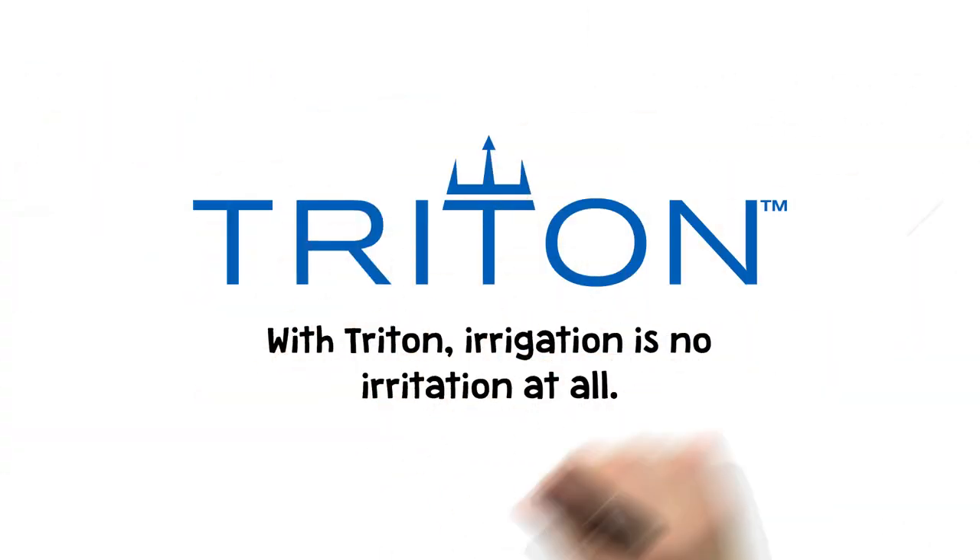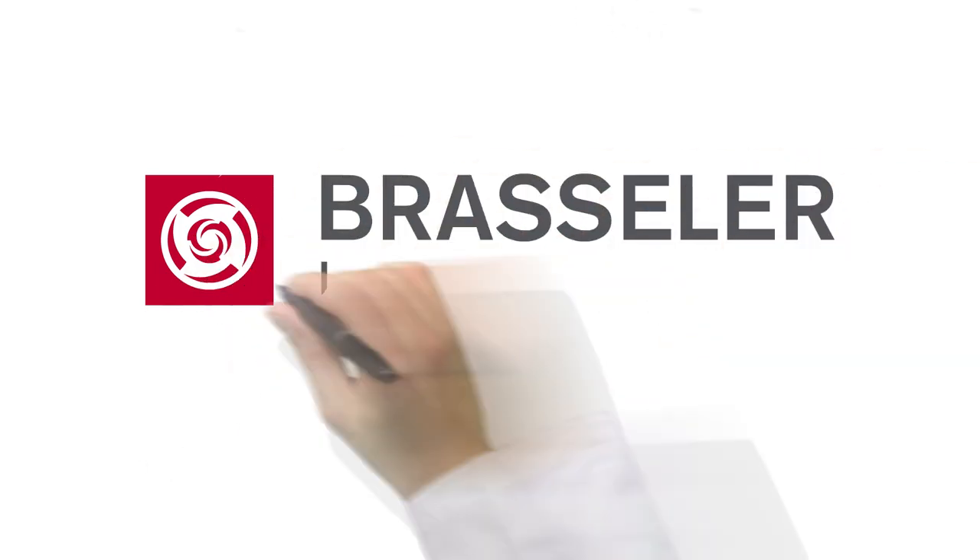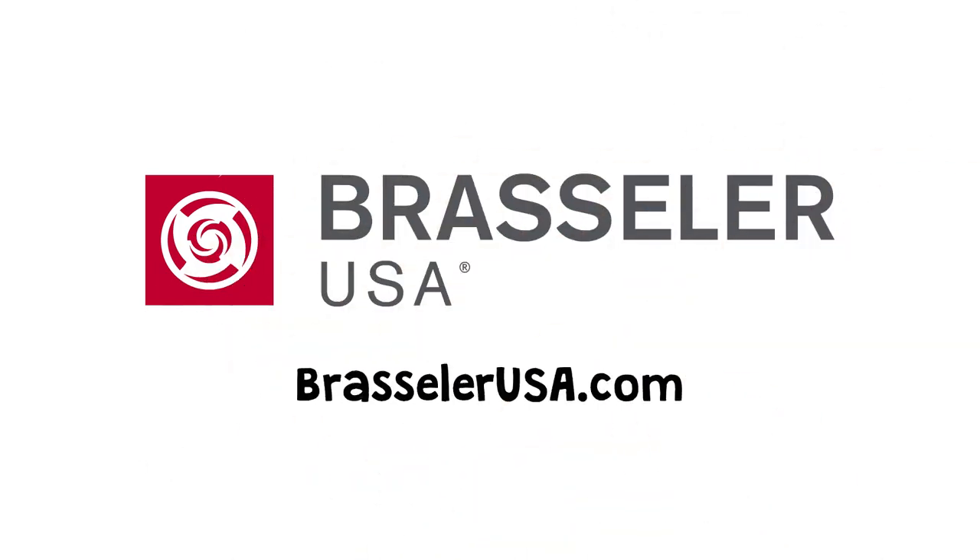With Triton, irrigation is no irritation at all. To learn more and to review the latest research, visit BrasslerUSA.com.